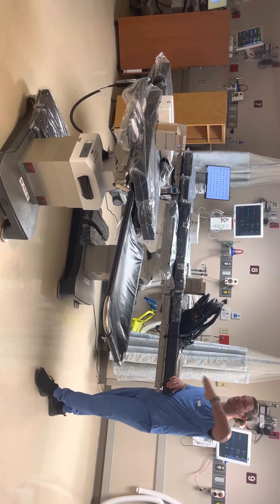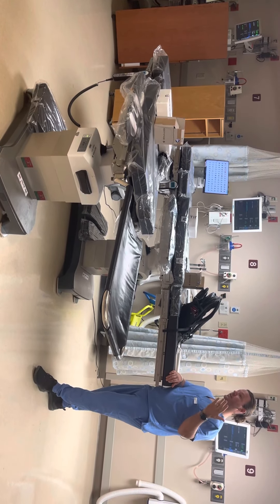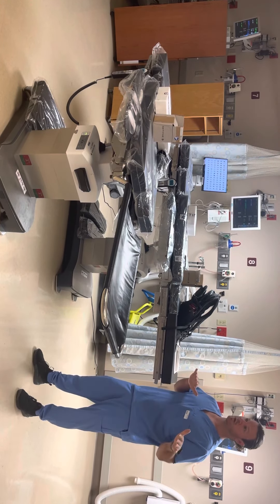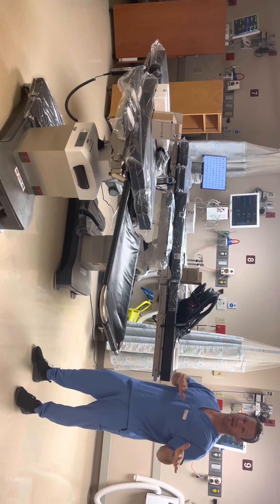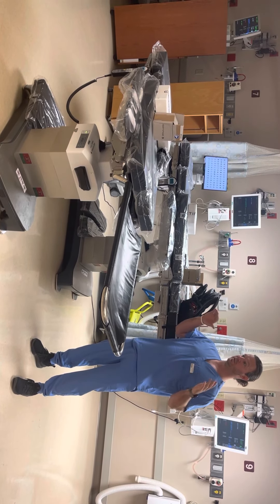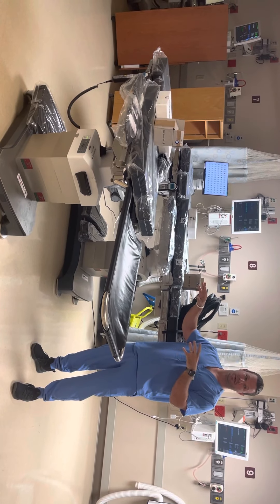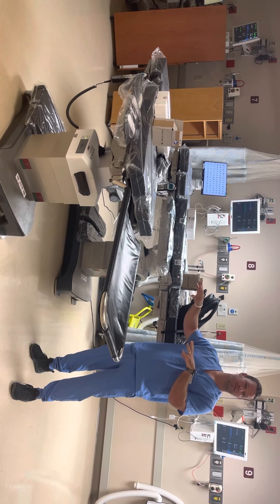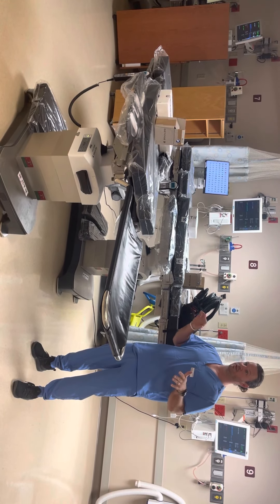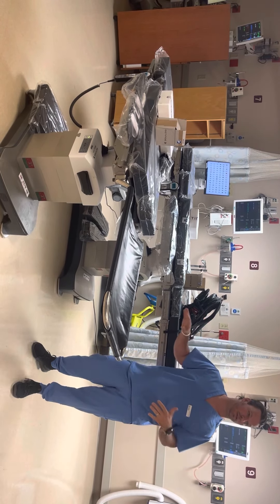The table will do 35 degrees of Trendelenburg, 25 degrees of reverse Trendelenburg, it has 20 degrees of tilt in both directions, and it also has 12 inches of horizontal slide in either direction that is motorized. All of this is controllable from the column and from the handheld remote. Your anesthesiologist should be very happy about some of that head access.